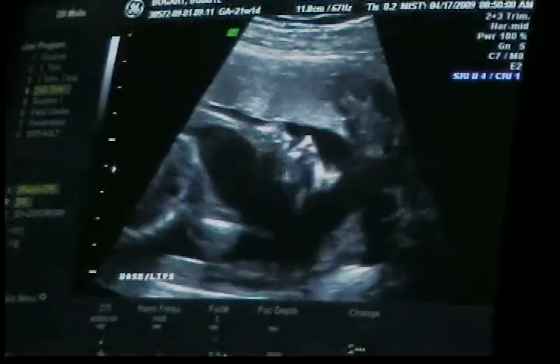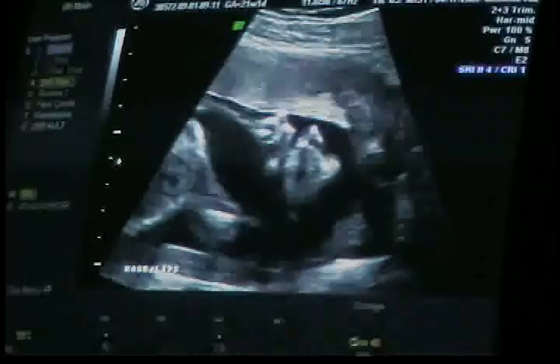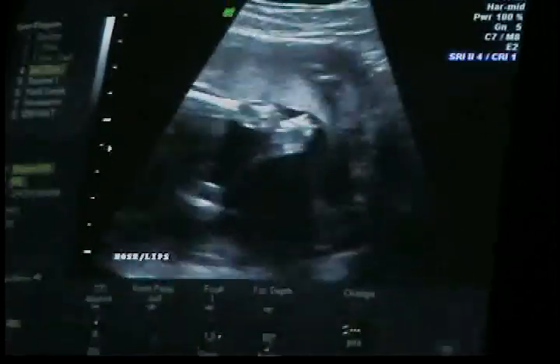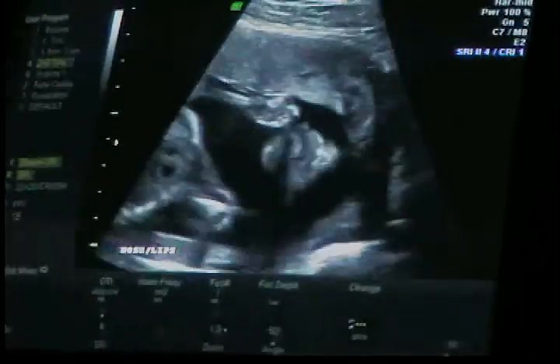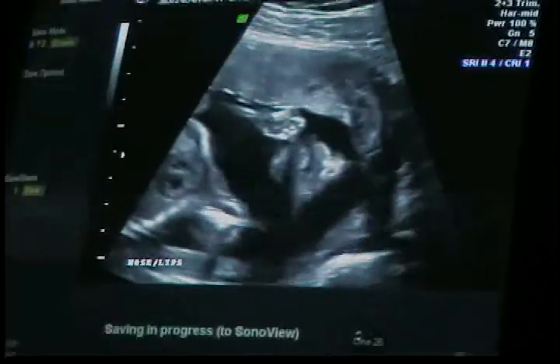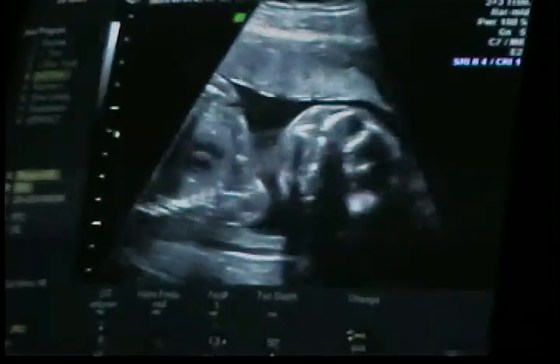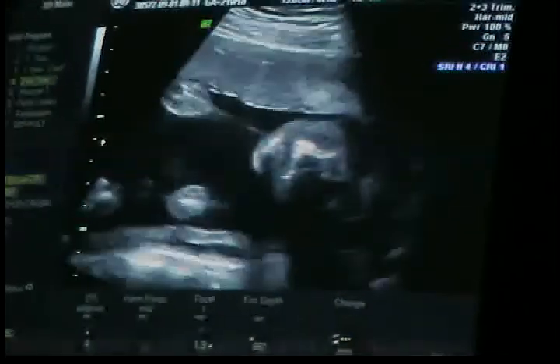So y'all don't have any 3D sonograms, huh? We have 3D, 4D on this machine. We don't usually do those until after 26 weeks, but if I get a good profile, I'll throw it on just to kind of give you an idea what it looks like. But those are kind of separate exams. Yeah, we aren't going to do them, because if we want to be surprised on the sex of the baby, it kind of defeats the purpose to know what it looks like.